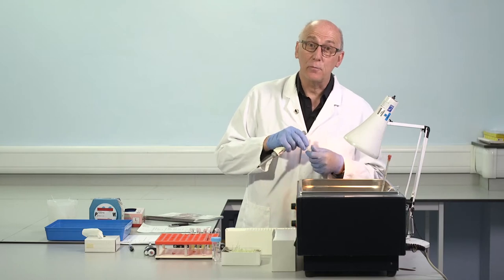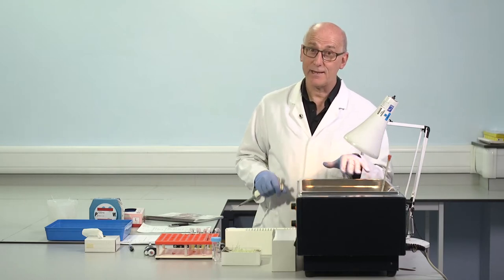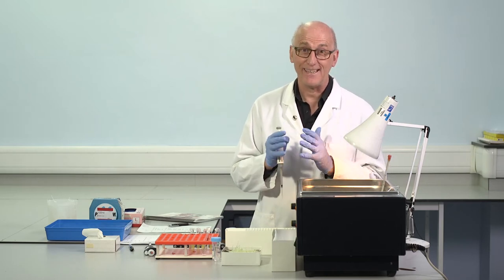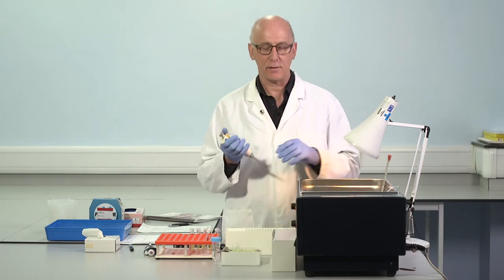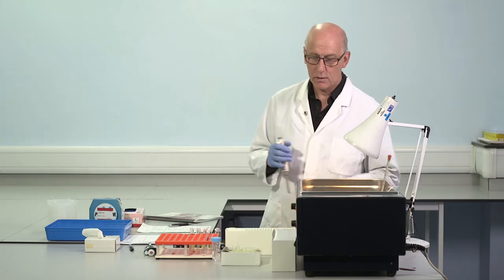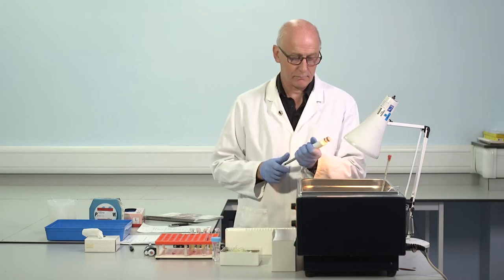So this now needs to come to temperature. It needs to come up to 37. We're performing this test in a glass tube, and glass is an efficient transferer of heat. So the small volume will quickly come up to temperature. So 1 to 2 minutes is acceptable. We need a fresh tip for each pipetting exercise. These are disposable pipette tips.